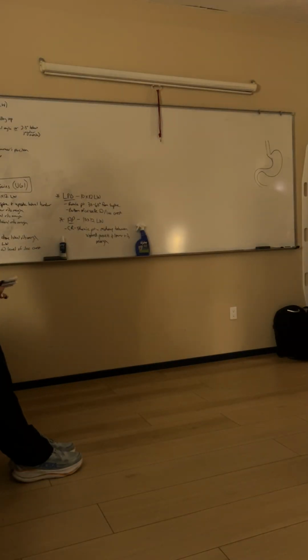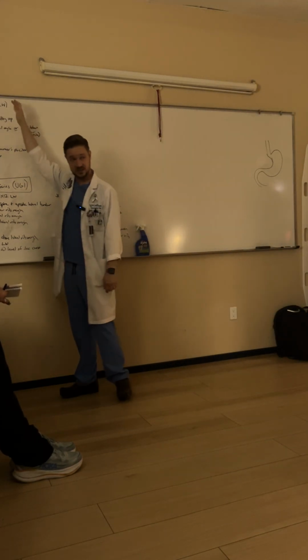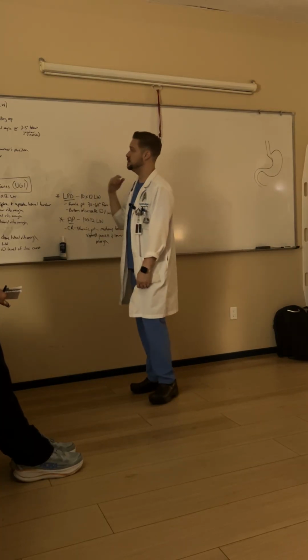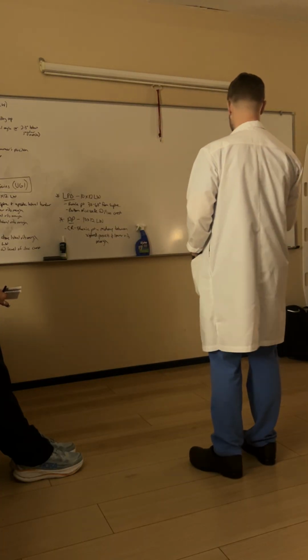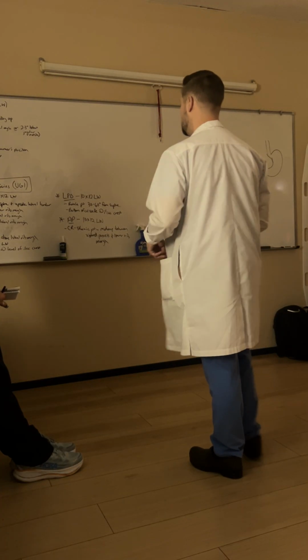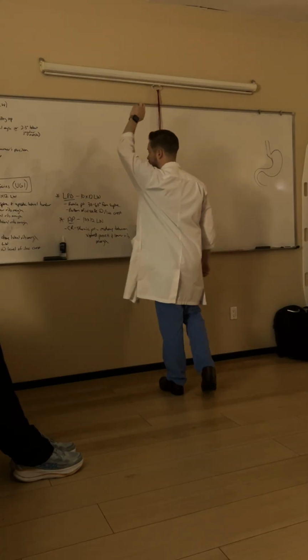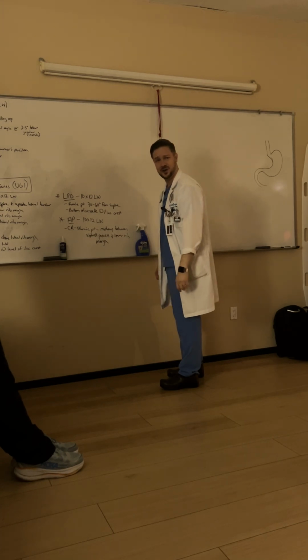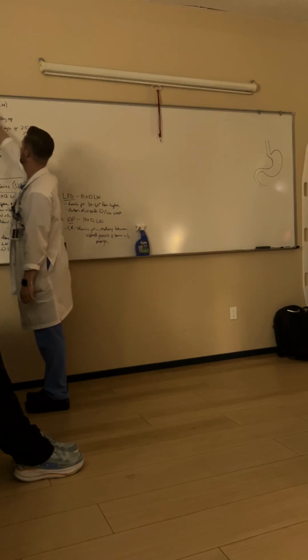If we're just doing an esophagus or an esophagram, I'm going to use a 14 by 17 lengthwise cassette. Makes sense. The esophagus is about right here. Okay. The first position we'll do is an RAO, 35 to 40 degree oblique, not full 45. Okay. Their left arm is going to be up. Okay. And their right arm is going to be down, or it could be holding a cup. Depending on the position, it's kind of hard to hold a cup if you're in RAO position. So you'll probably have to help them drink out of that cup, okay?